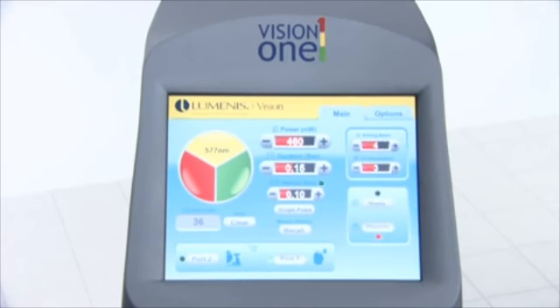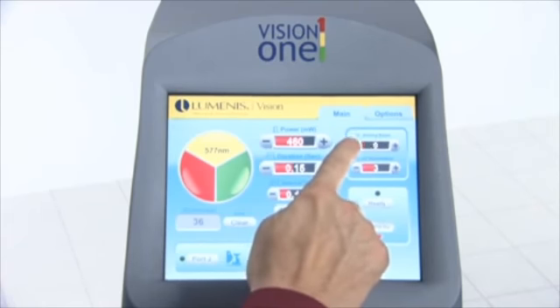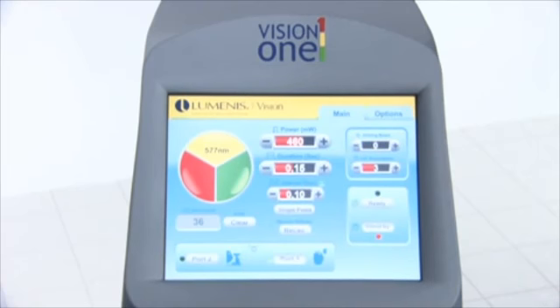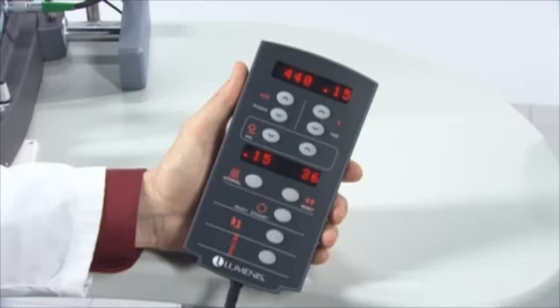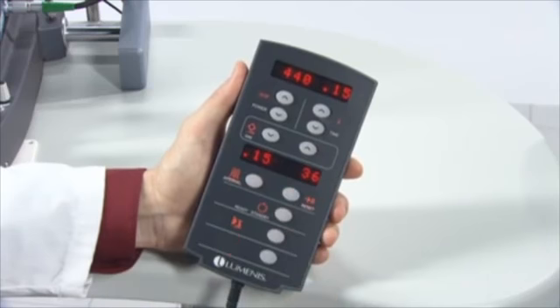To adjust the aiming beam intensity from the control screen, press the plus, increase, and minus, decrease selectors in the aiming beam field. To turn off the aiming beam, press the decrease selector until no bars illuminate in the aiming beam display on the control screen. The aiming beam can be turned off only when the laser is in standby mode. To adjust the aiming beam intensity from the remote control, press the up, increase, and down, decrease selectors in the field.